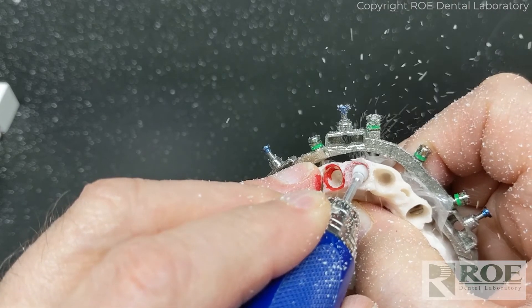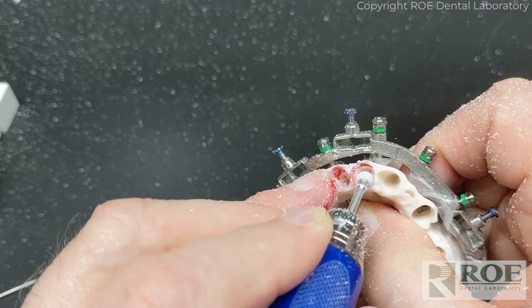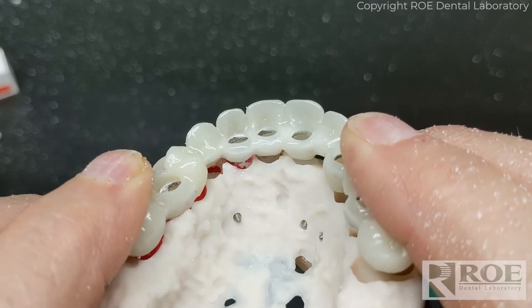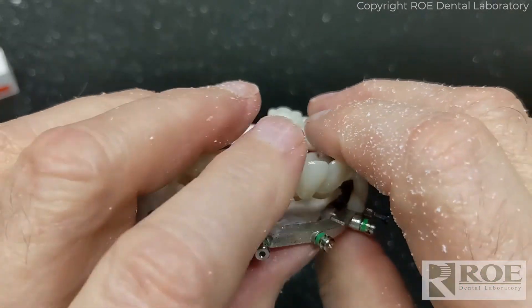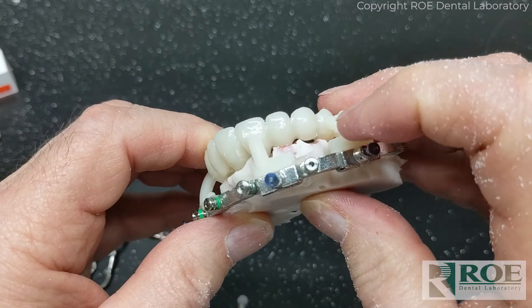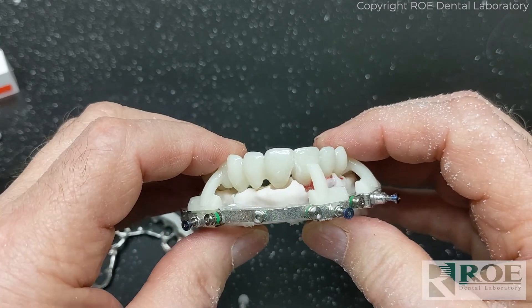Without the scallop guide in place, I'm checking for fit. There are a few little corners we might have to adjust to allow this prosthetic to go down in place. After adjustment, I put the prosthetic in place and find there are no more interferences. Turning the prosthetic around, I can see all the box inserts are seated down against the fixation base, which means we're down and enough bone reduction has been done to allow seating.